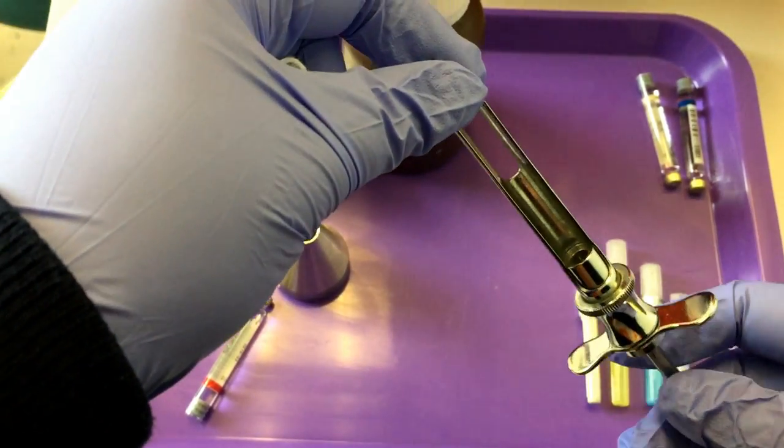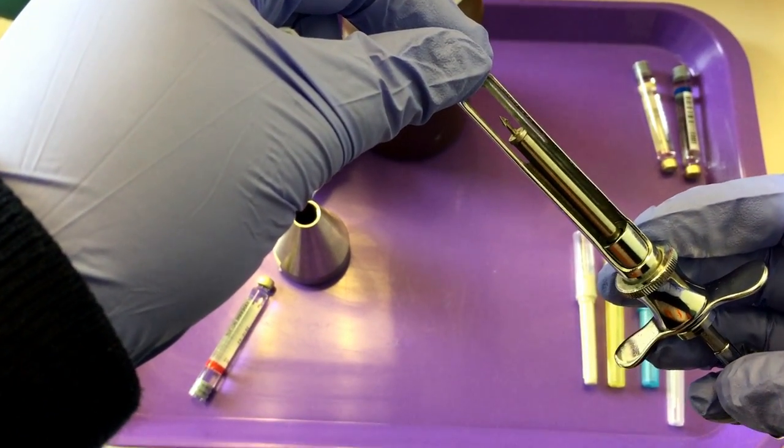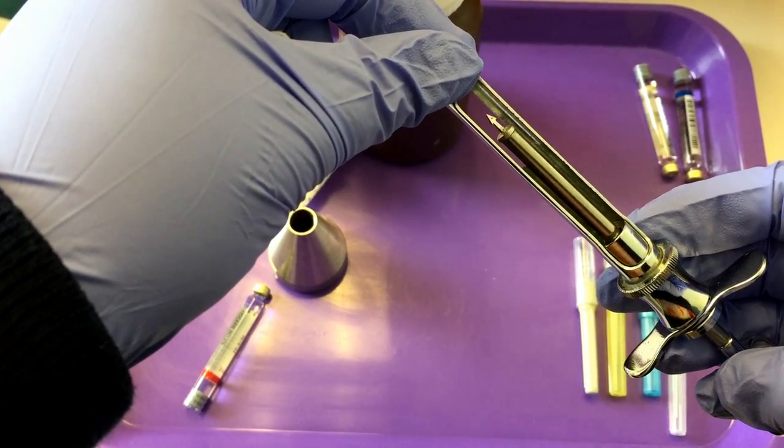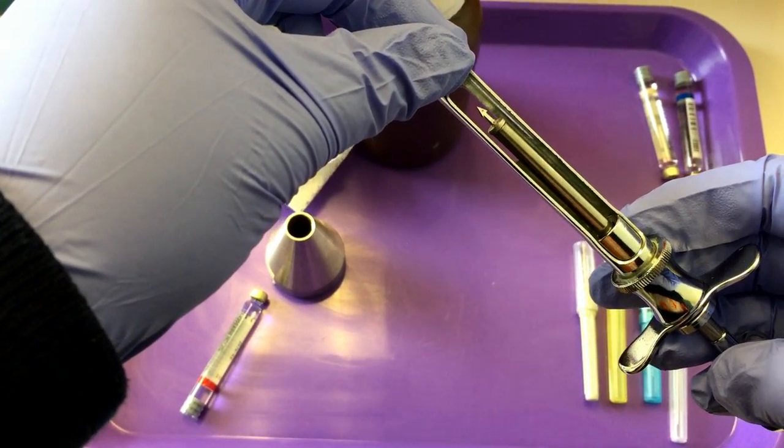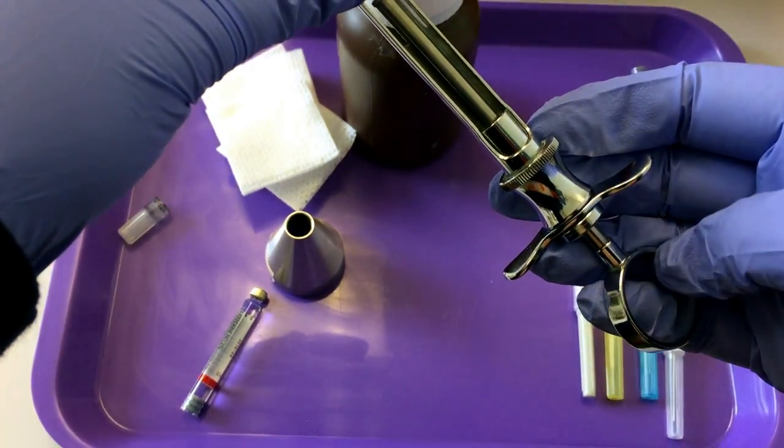This is called an aspirating syringe. If you notice the harpoon, this little arrow-shaped pointed end, that's what's going to stick into the rubber stopper, and we have to engage that by tapping on the thumb ring.